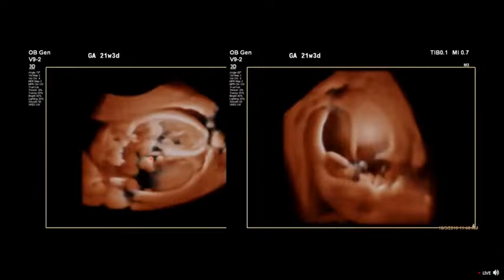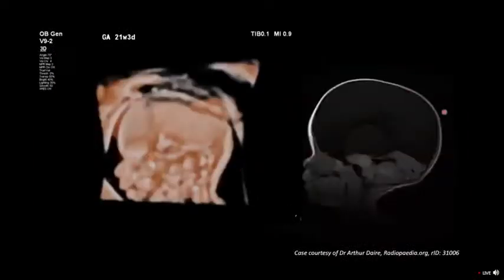And with the light, we're able to show them so much more specifics about the particular diagnosis. We could send her to an MRI, but interestingly, that mid-sagittal Michelangelo view of the fetus shows the exact same thing as the $3,000 MRI. Facial profile is the same. You can see the incredibly empty cerebral hemisphere here, and same on the MRI. This is not her baby; it's just a representative picture.